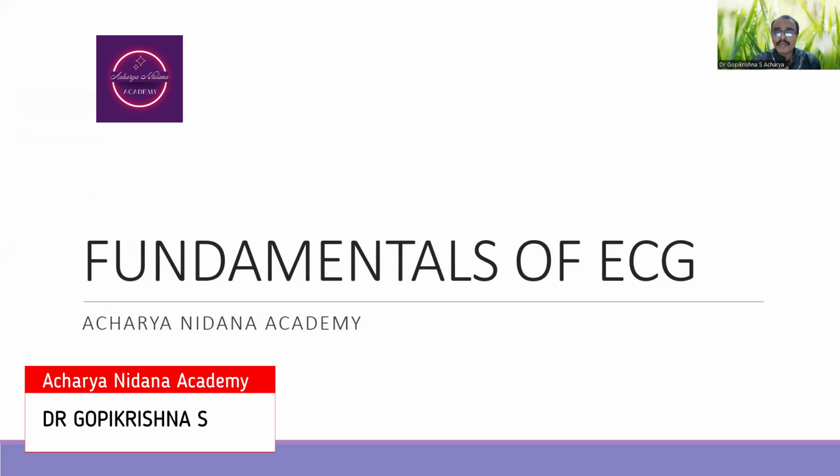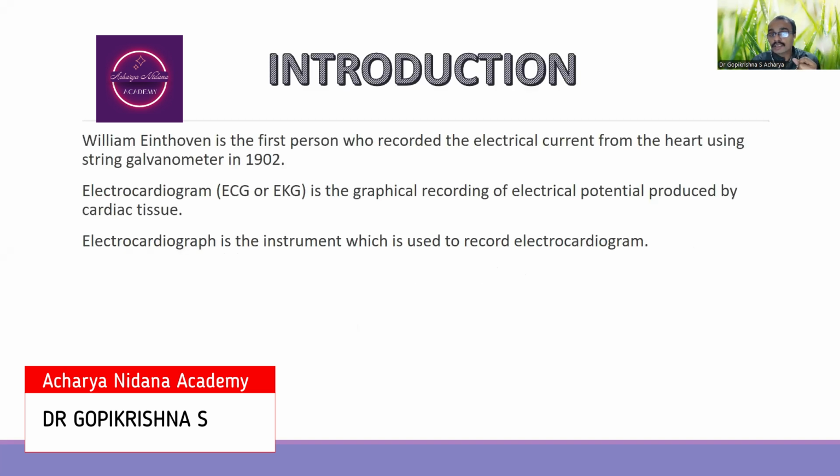When you think about the fundamentals of ECG, we will go through a little bit of history and some of the physiological aspects: why these particular wave patterns occur, and what we mean by depolarization, etc. We are also going to see what we mean by the vector, and in what ways this is helpful in analyzing ECG. We are going to discuss this in this particular video.